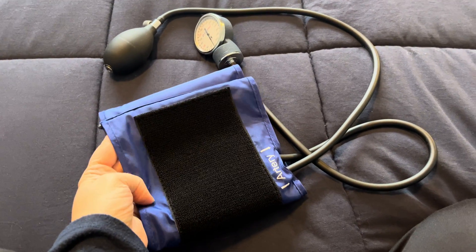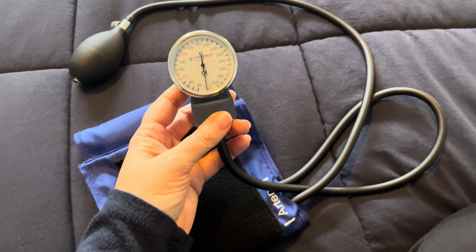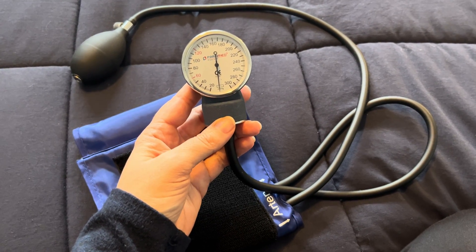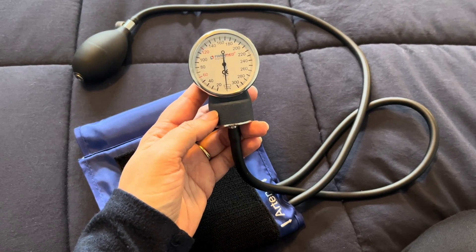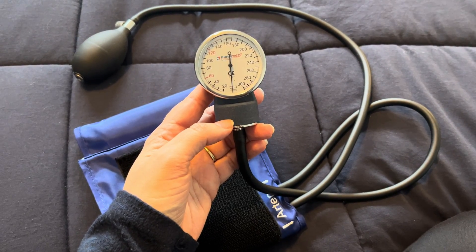I got this blood pressure cuff a couple years ago when I took a CNA course, and what I really like about it is that it just worked exactly how it should. I found that all of us students had different quality materials, and it's a lot easier to be successful if you have good quality materials.